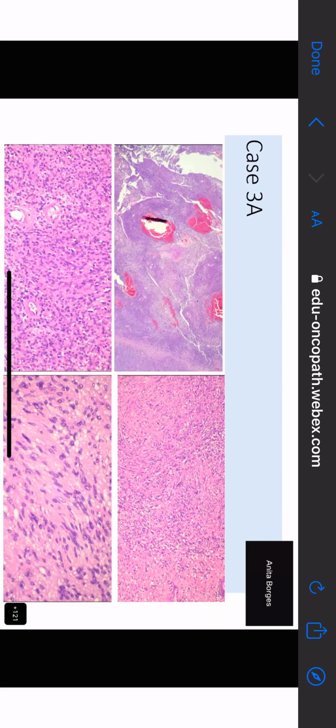I thought it was schwannoma, ma'am. It looks like a schwannoma. All right. So you think it's a schwannoma. Yes, ma'am. Very good. What about you, Dia? I thought it's a vascular transformation of the lymph node, probably a nodal angiomatosis. Nodal angiomatosis. All right. And we have now Suvaita.